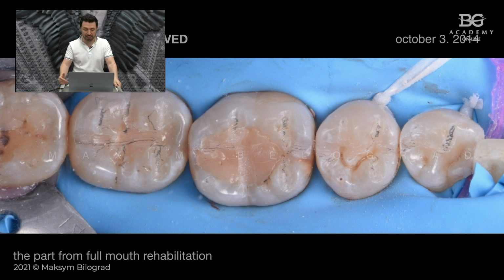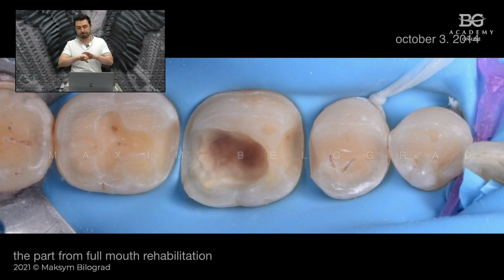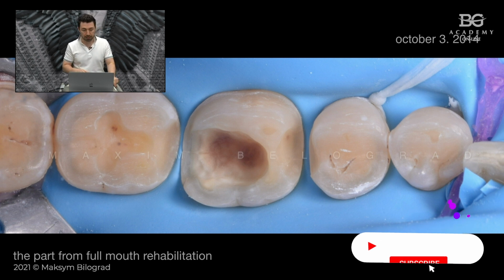The next step will be to merge these grooves and also to prep, considering the initial clinical conditions that we have in that particular case, like caries defects, some cracks, old fillings, secondary caries, aesthetic needs from the patient side, and so on and so on. So here you can see the step 1 preparation that was over.